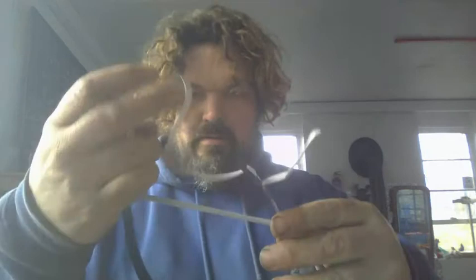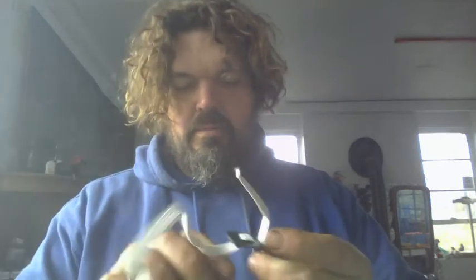So, it's the same. You just go to the shortest. Okay. And it needs to be a bit tight. So, it needs to be hard to reach this because you don't want your face straight on the screen.